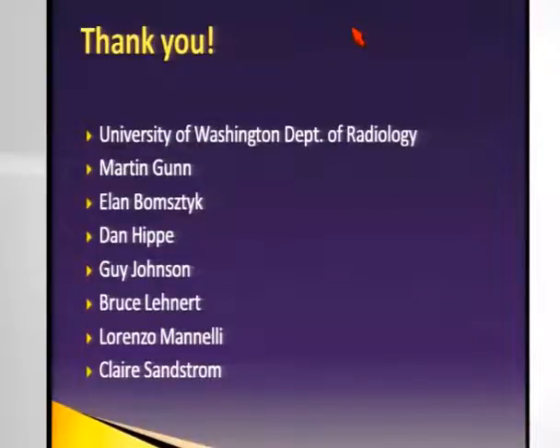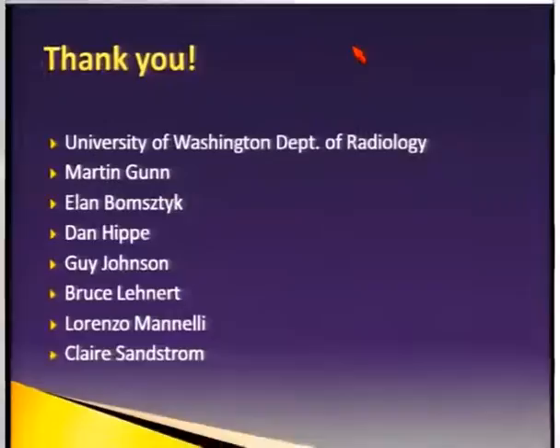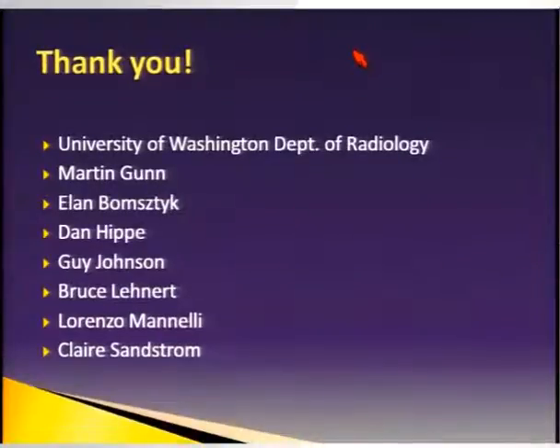In the case where you would recommend a delayed phase, where on the contrast it's somewhat suspicious, so you want a post-contrast delayed, how delayed is that scan typically? What's the recommendation? You know, I don't have a good answer for that. I can come up with one, but there are better people than me, I think, to answer that question, so sorry.